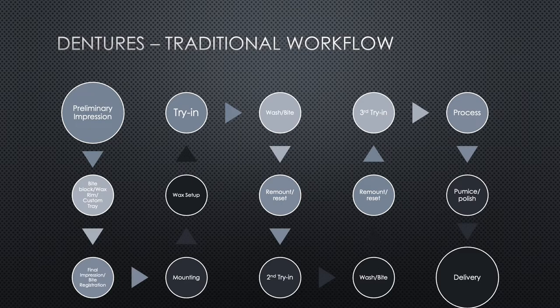And you have to imagine, like, even the best denture technicians, setting up teeth and waxing things up, you're 40 minutes to an hour for one single setup, right? And if you have to go back to do it, and the second try-in doesn't go well, you have to tear apart all these teeth, put them all back together, that's another 40 minutes, an hour. With digital, if I'm doing a reset, I'm maybe tweaking a couple things. It's 6 minutes, and three of them are just waiting for things to generate inside 3Shape.